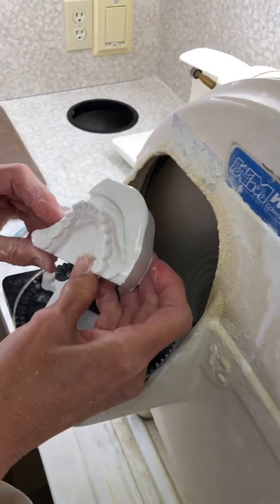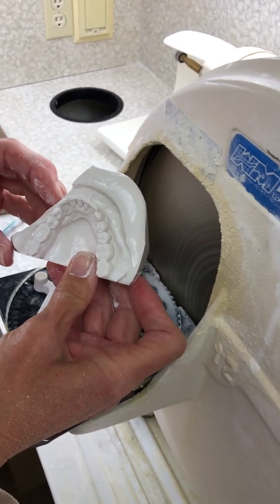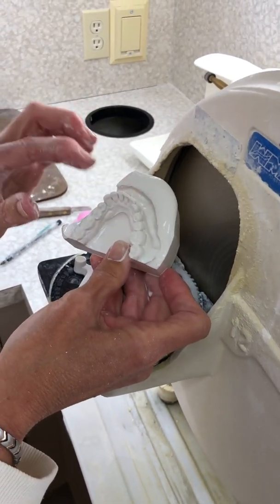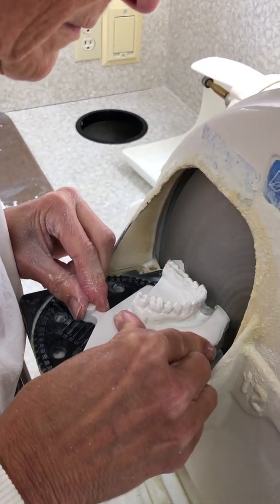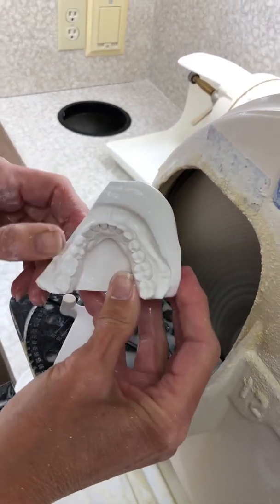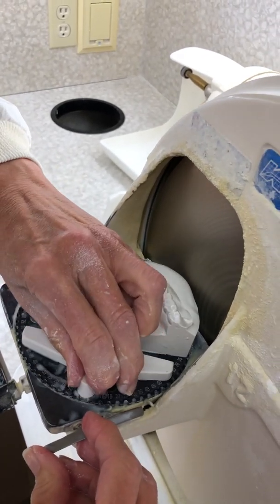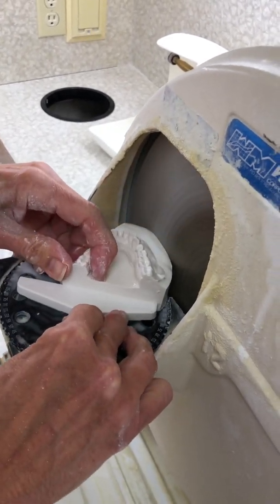All right. Now, if you're not sure exactly, stay out a little bit further than you need to, so that you're not ending up cutting the teeth. With a nice curvature of this one, it's not as hard, but when you start having teeth that are in and out, you really have to watch that, okay? So I'm going to take it a little bit more. So that's about where you want to be, all right? So right in there, right at the bottom. Now, I want the other 55, and you want them to basically be about the same distance away. So there we are at 55 again, and we'll just push in.